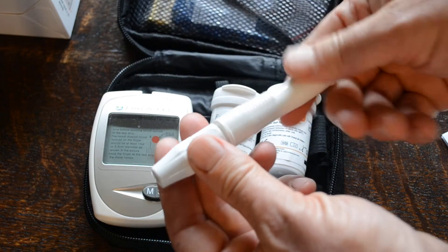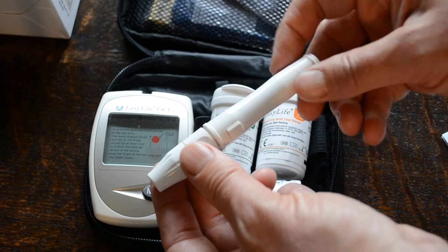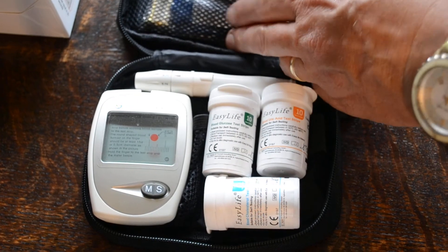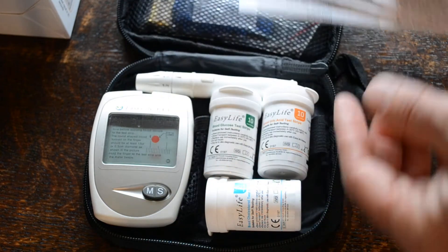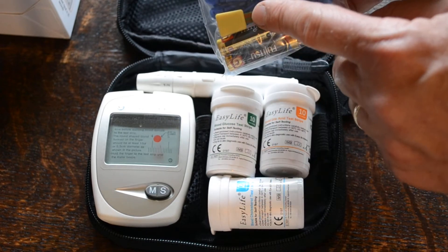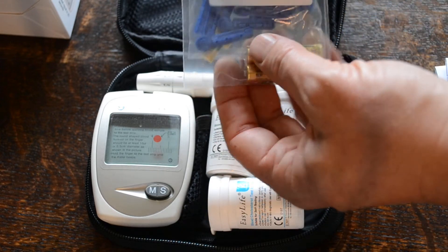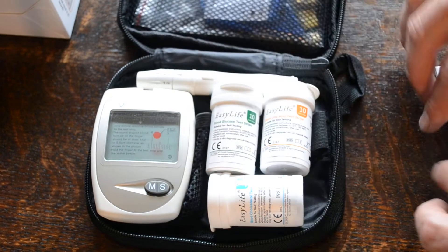This is the auto lancing device, which is a spring-loaded lancer, so if you don't like the idea of having to stab yourself with the lancets, this bit of kit basically does it for you with a quick release. In here you have the instructions for each set of test strips, batteries, a reset code chip which can be used for calibrating the machine if necessary — but you don't usually have to do that — and you get a set of sterile lancets, enough to do all the test strips provided with the meter.